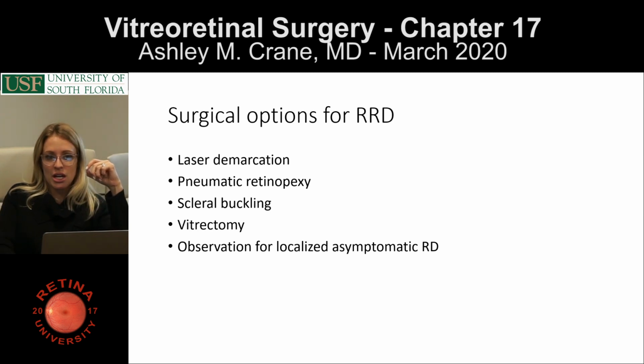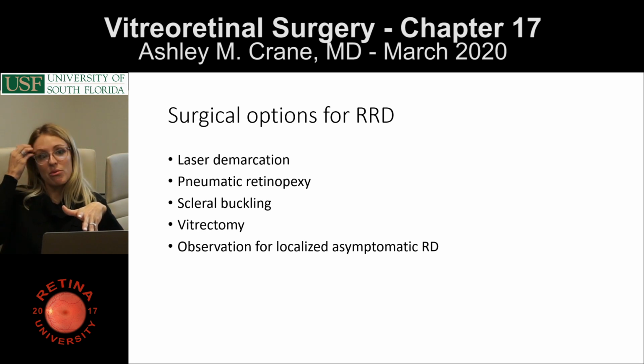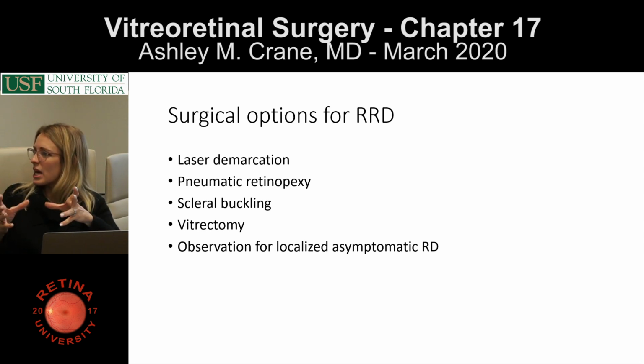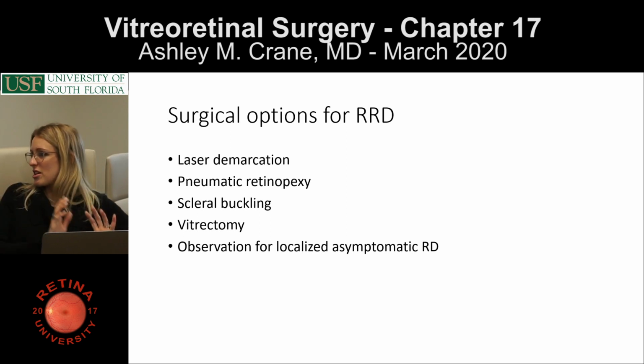Laser demarcation is an option for small detachments. So if you have a question, please ask someone before you laser demarcate a detachment. I have seen some residents laser demarcate enormous detachments, and then it makes the surgeon's life way more difficult. So if there's any question like, oh, is this too big? Or if you start and you say, oh, I'm not taking up in this small area where I thought the detachment was, maybe there's fluid around it, don't just keep going farther and farther. Just stop and ask the question.